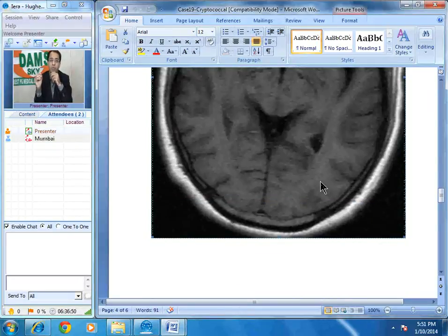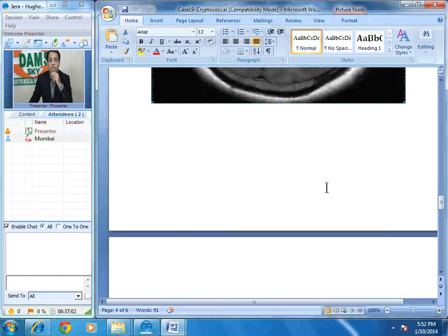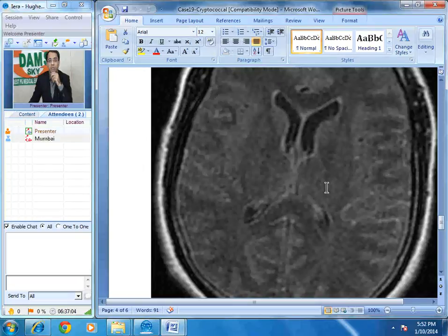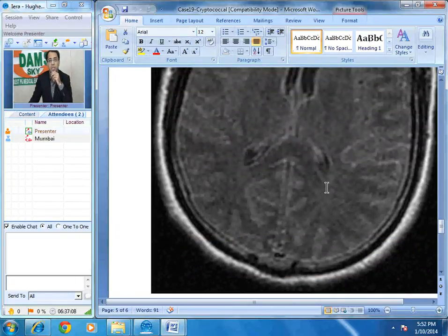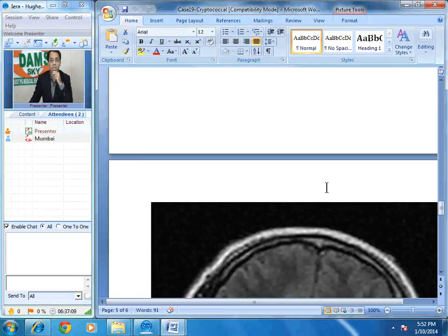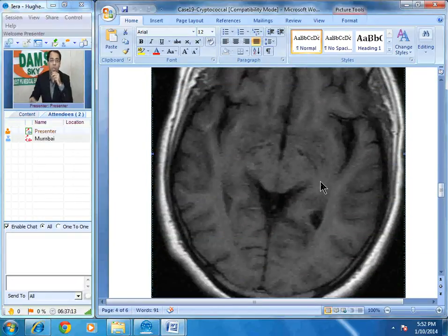So what is the diagnosis? We have effacement of the cerebral sulci, FLAIR hyperintensity, clinically suspected meningitis, and punctate areas of T2 hyperintensity in the brain stem and gangliocapsular region. These findings have been found to be characteristic of a disease called cryptococcal meningitis.